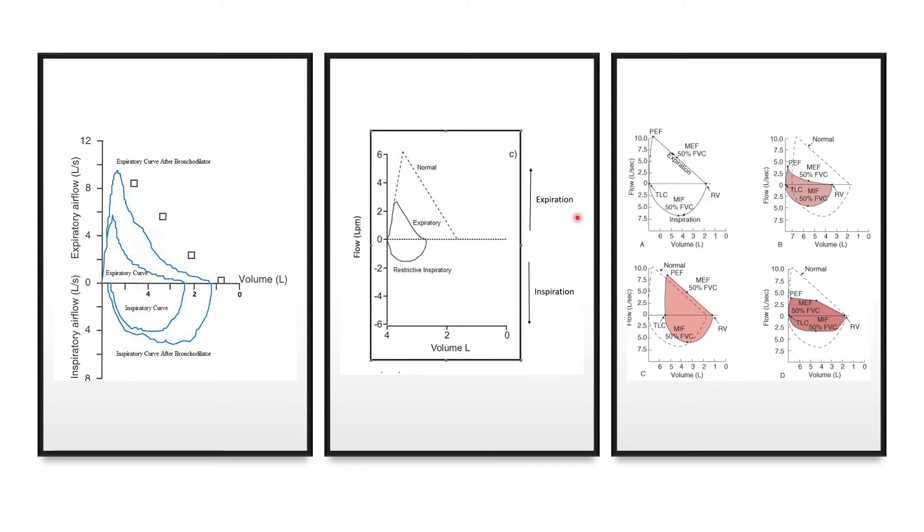In these three examples, you'll see that the x-axis is labeled such that the zero point is to the right of the graph. This is one convention you may see.